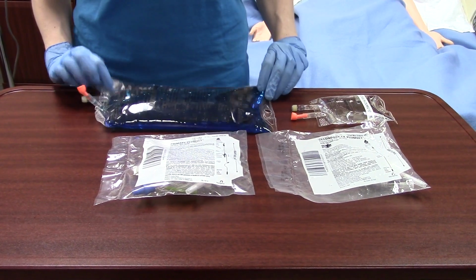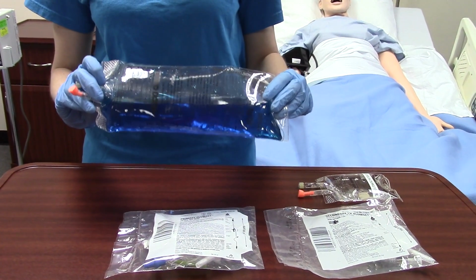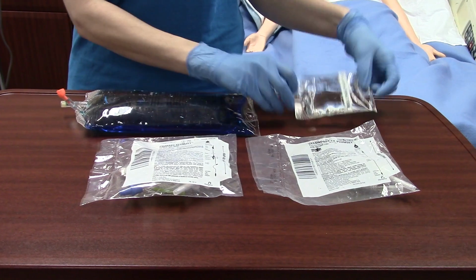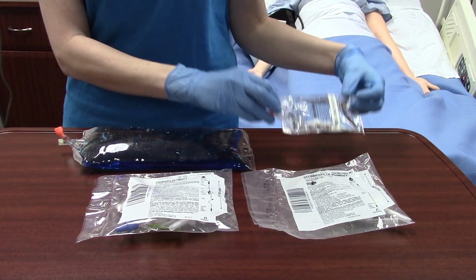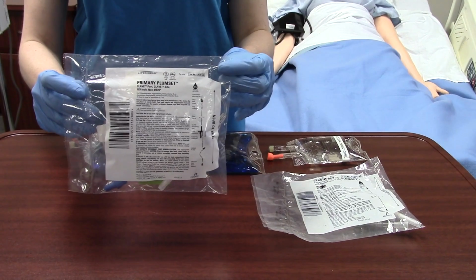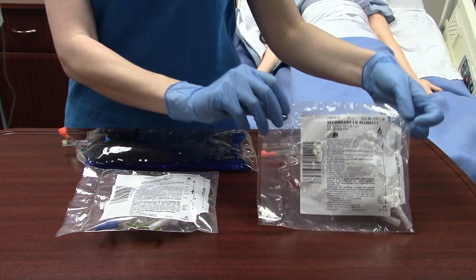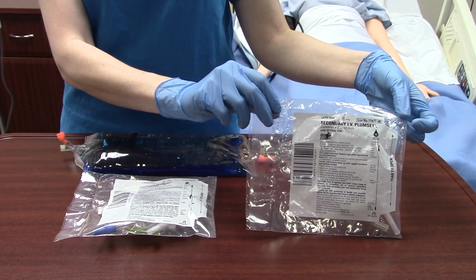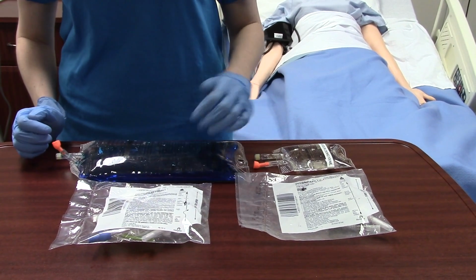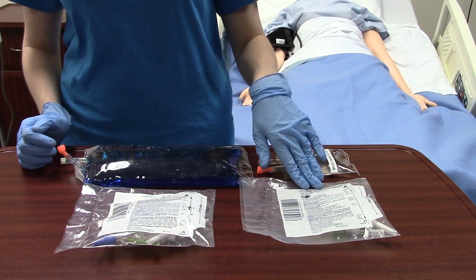Today, for instructional purposes only, we have fluid that is colored blue so you can see priming easier. This is our primary bag. This is our secondary bag for an antibiotic. We have primary Plum set tubing that will go with our primary fluids, and we have secondary Plum set tubing that will go for our secondary antibiotic set. No matter what the brand, you will always have primary tubing and secondary tubing.